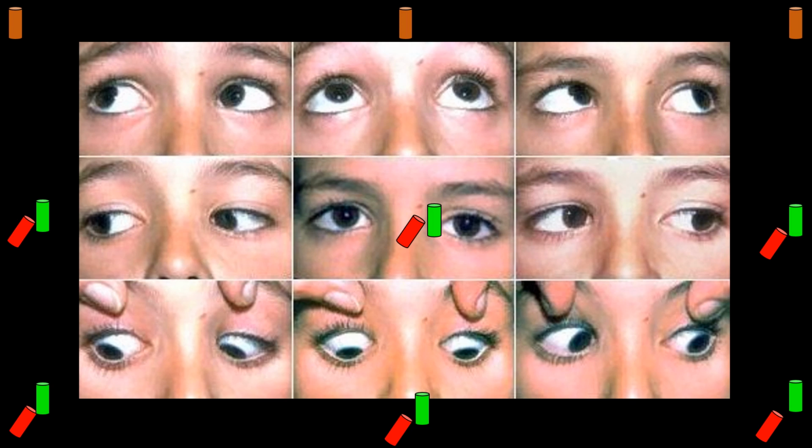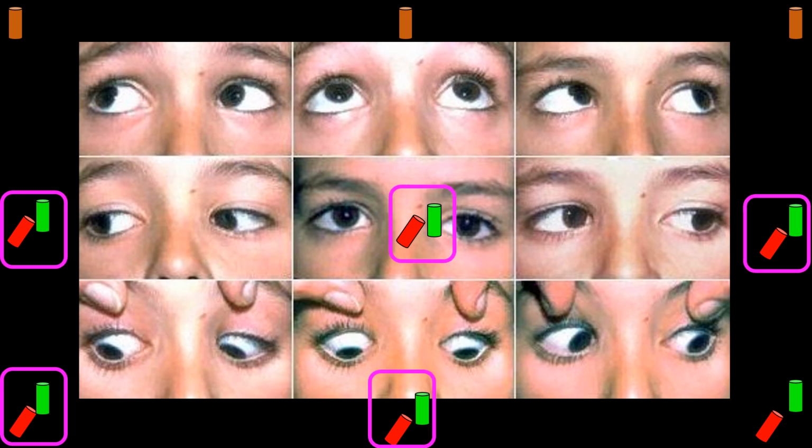These findings are expressed in the bar diplopia chart as yellow-brown bars in the upper gazes and different degree of bar decoupling in all other positions of gaze. The bar's separation is maximal in levo depression, corresponding to the higher degree of hyperdeviation in this direction of gaze than in all other directions of gaze where it is present.